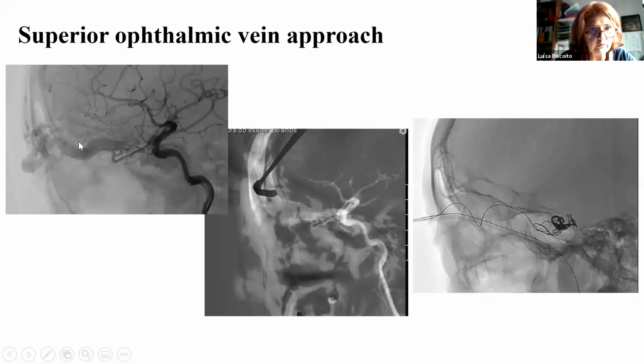We had a roadmap at the beginning, before stabilizing everything, to see with the guide wire if we are in place. And then after stabilizing all the device, we worked and immobilized with coils like we were working on the femoral approach.